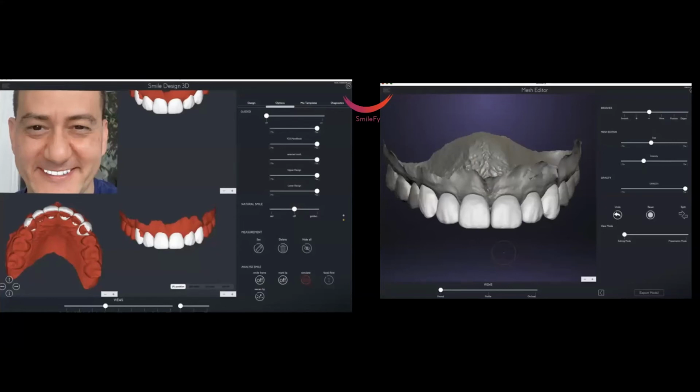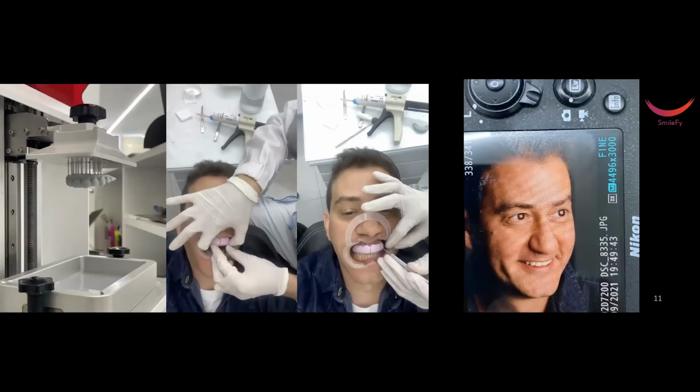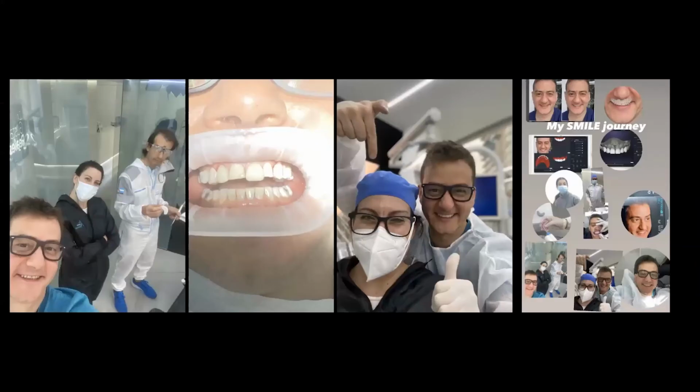I went to Buenos Aires before taking a plane. Ralph designed it when I started in Buenos Aires. I have all this. Okay, mock-up. Then they did the injection flow technique for me because I believe in this.